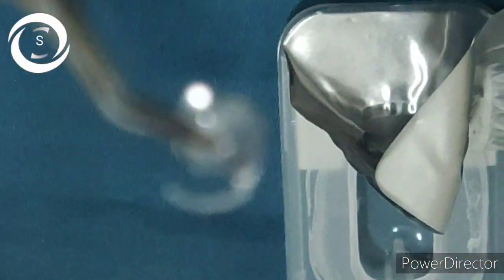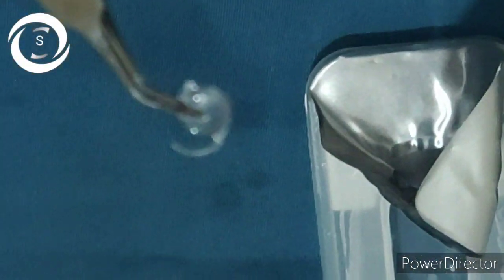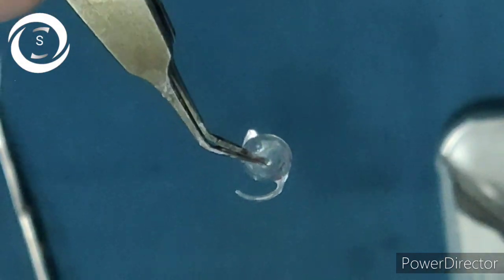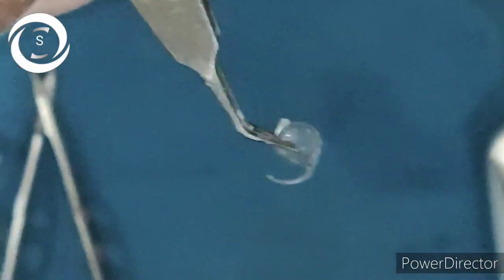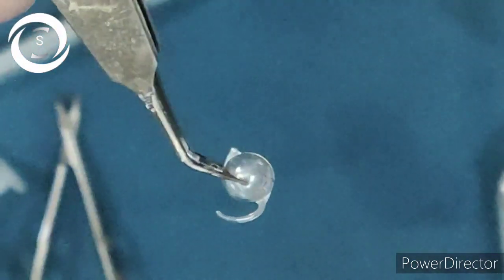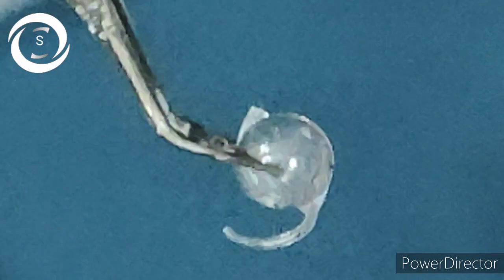I told my assistant that I hoped it would end smoothly and very soon — it's a very easy cataract for me. I performed the phaco emulsification within minutes, but while injecting the foldable IOL, one haptic broke from the IOL at the optic-haptic junction.